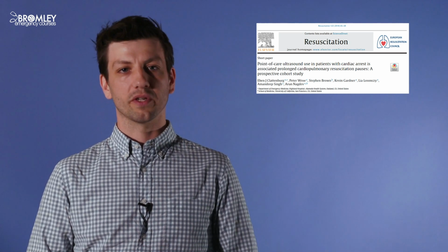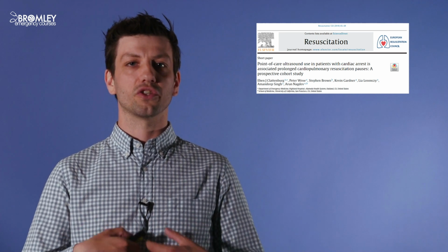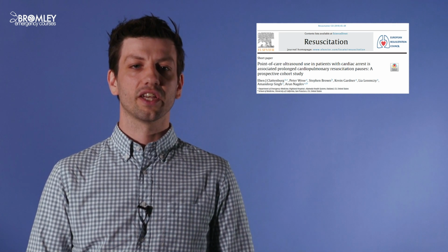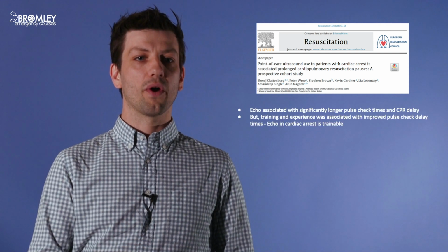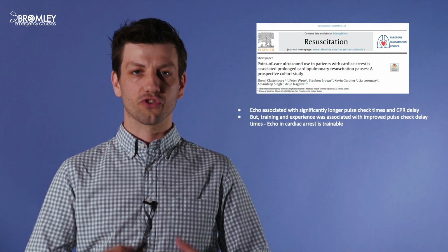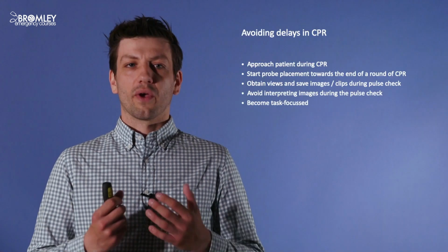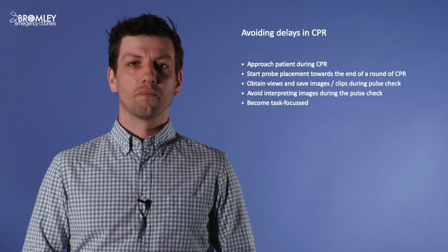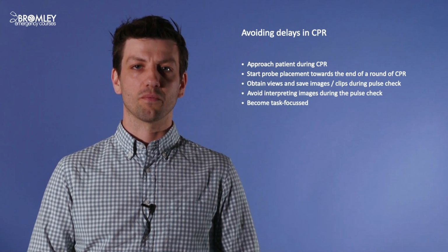There have been a few papers published in the last few years that have all shown that doing echo during cardiac arrest delays the resumption of CPR after a break. However, all of these studies suggest that echo is trainable. So with training, that pause can be reduced. So how do we avoid delays in CPR? The first thing I would say is approach the patient whilst chest compressions are ongoing.